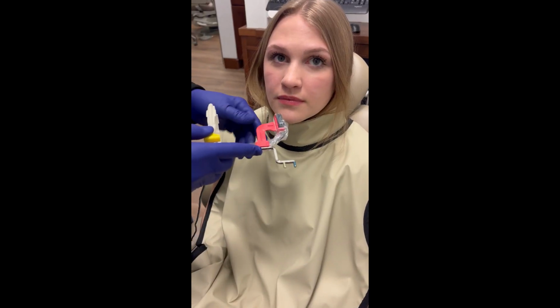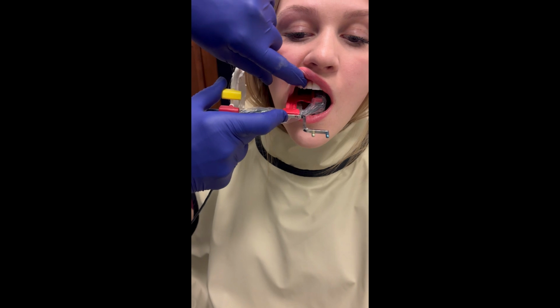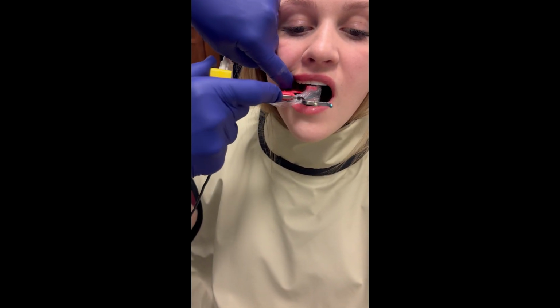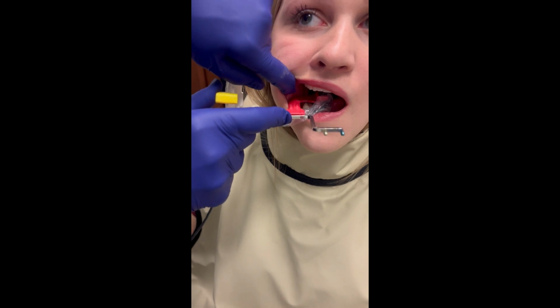All right, for the next bite wing, we're going to get the molar image. I'm going to again try to set this in the middle of the patient's mouth. Sometimes I'll use their midline to line the sensor up, and I want to gently push their tongue over so the patient knows I'm going to be placing this between your tongue and your teeth. And I'm going back a little farther with this.